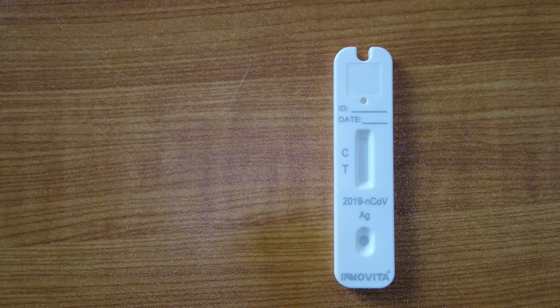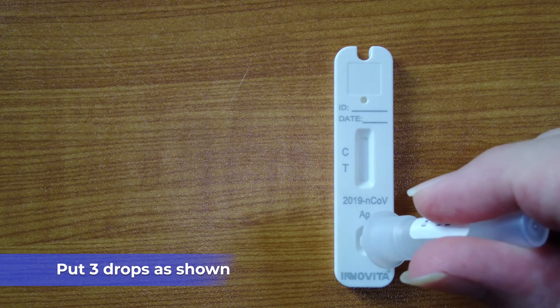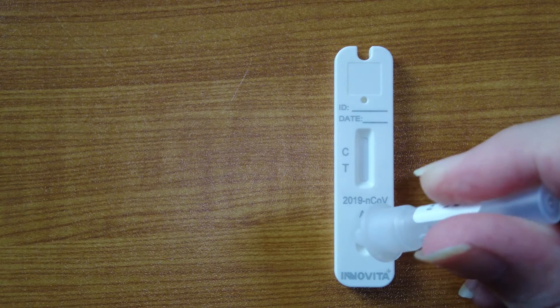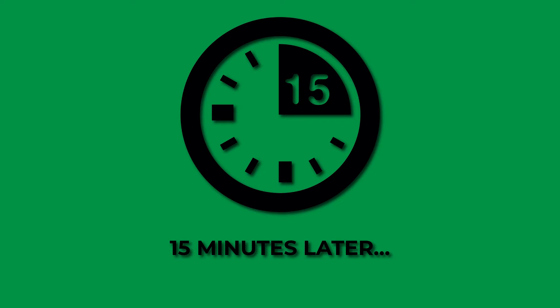Next we open our test. The test is shown. Then you will have to wait for 15 minutes for the test to be complete.